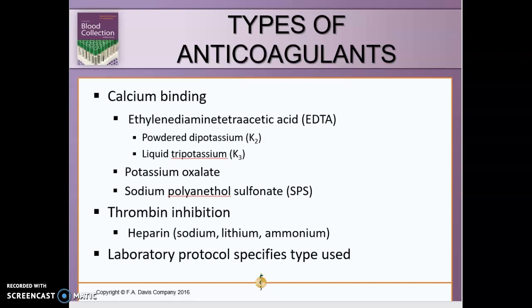When we talk about the thrombin inhibition, like your heparin, sodium, lithium, ammonium, they stop the formation of thrombin that is required to convert fibrinogen into a fibrin clot. So they stop that formation of thrombin.